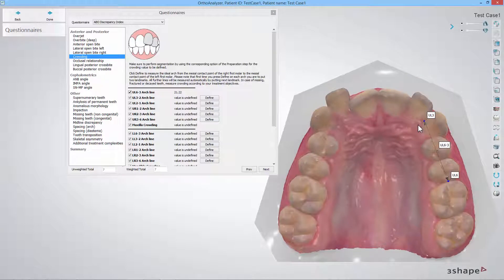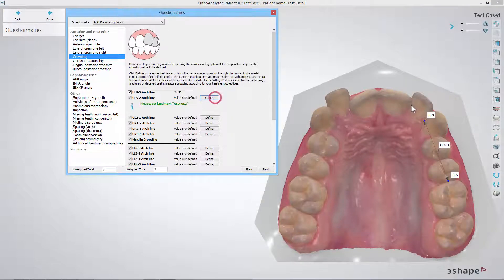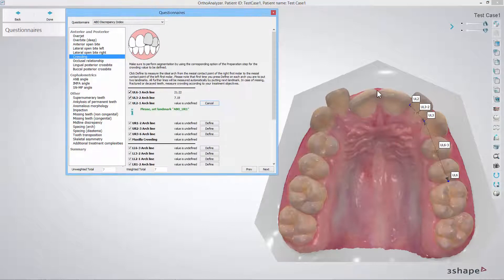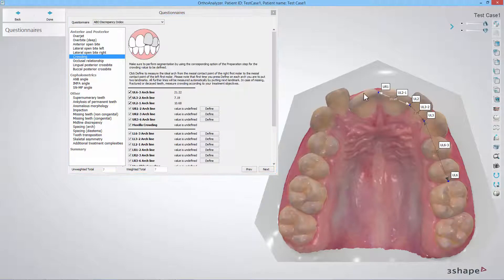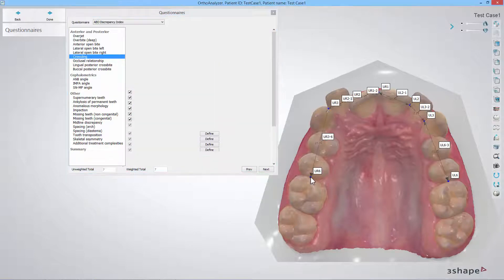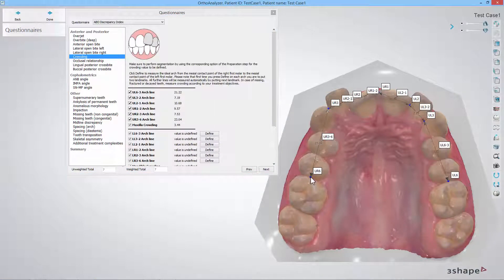Then press the next define button below and place one landmark to continue the ideal arch. Follow this process until the maxilla arch is completed from the left tooth number 6 to the right tooth number 6.